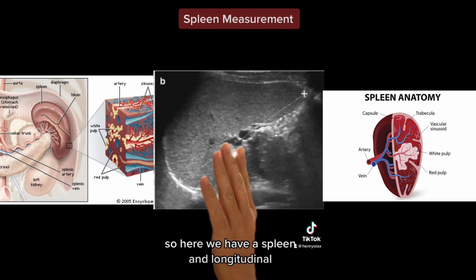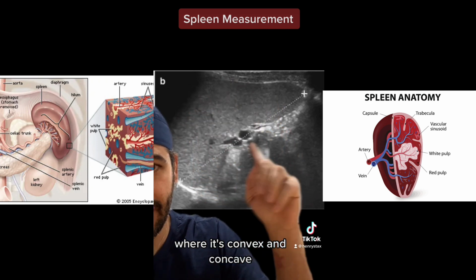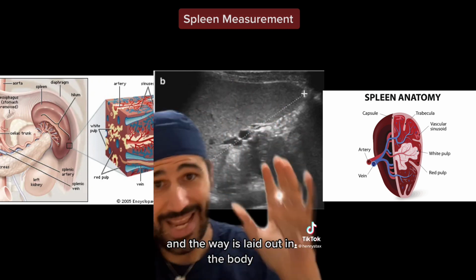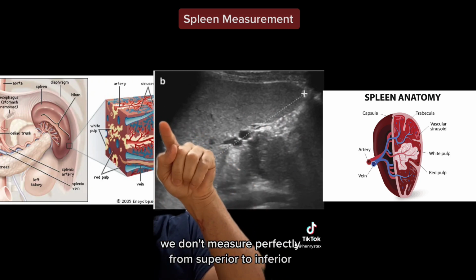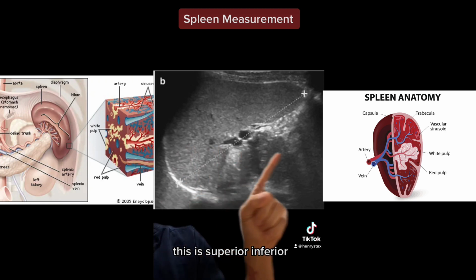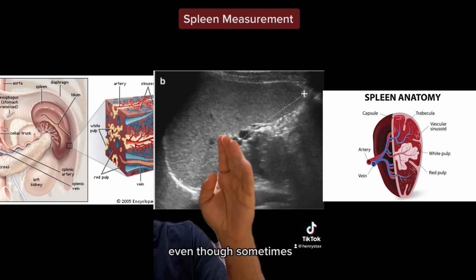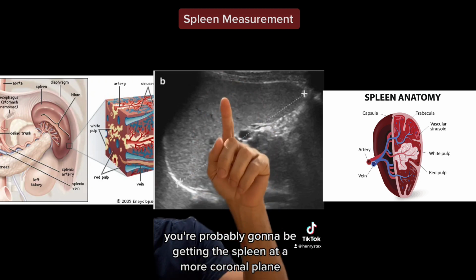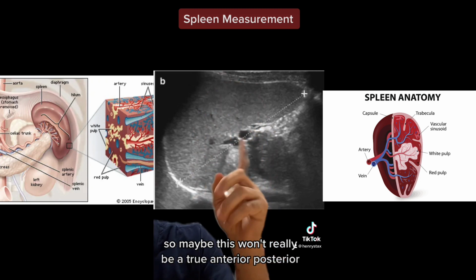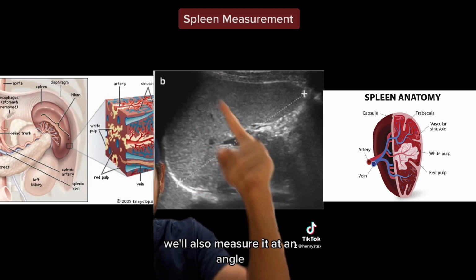So here we have the spleen in longitudinal, and due to the shape of the spleen, where it's convex and concave, and the way it's laid out in the body, we don't measure perfectly from superior to inferior. But we know that this is longitudinal, this is superior, inferior, anterior, and posterior. Even though sometimes you're probably going to be getting the spleen at a more coronal plane, so maybe this won't really be a true anterior posterior, but that's what we use. And we're not going to measure like that. We'll also measure it at an angle.